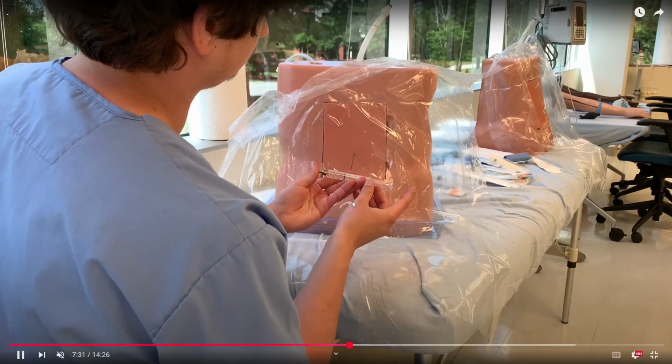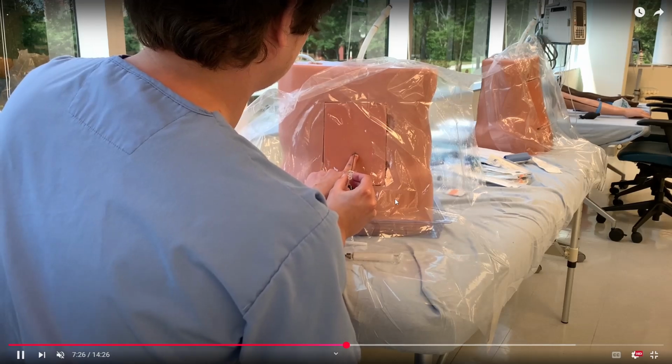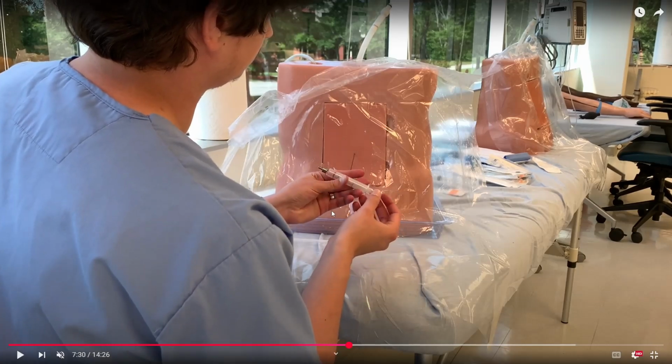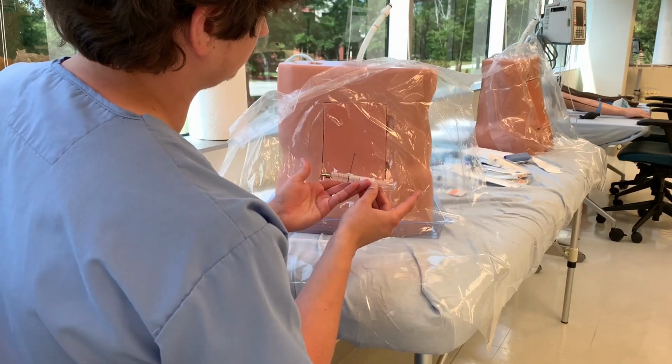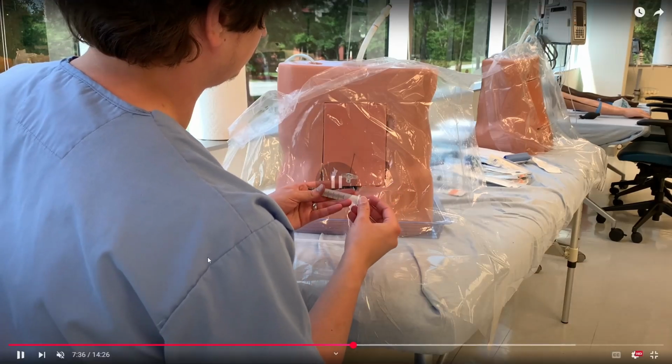So now I'm going to demonstrate the loss of resistance technique. What I want you to pay attention to is when my finger covers the tip of the needle, I can't compress the needle. It's going to always bounce back. But when my finger is not covering the needle, it just collapses. So watch. Won't go, will go. Won't go, will go. So this is the loss of resistance technique.